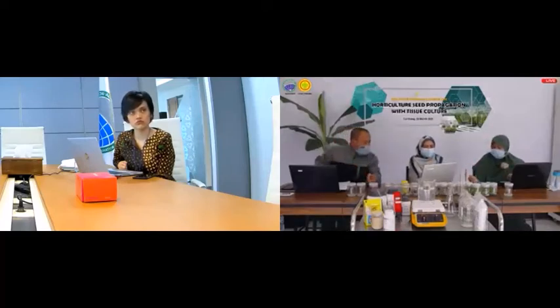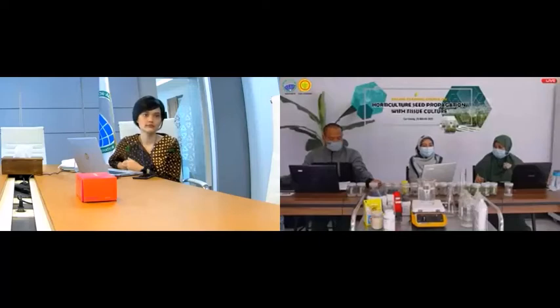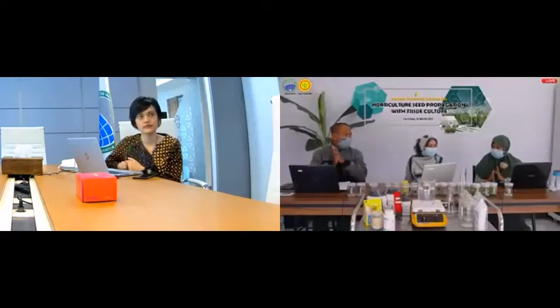There are a lot of sources of contamination when working in tissue culture, for example the bottles and the tools, and also ourselves after we come from outside the building, from the garden, and go back to the laboratory. We have to clean ourselves in a closed room, sterilize our hands using gloves, and make sure that we wear a cover cap to avoid contamination. So actually, there are a lot of sources of contamination.